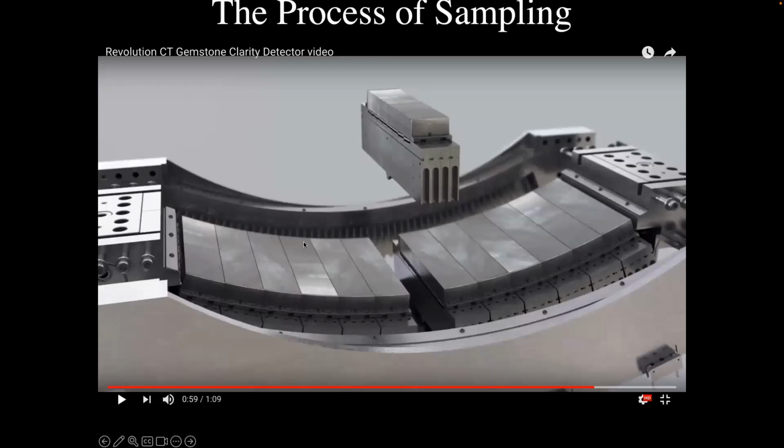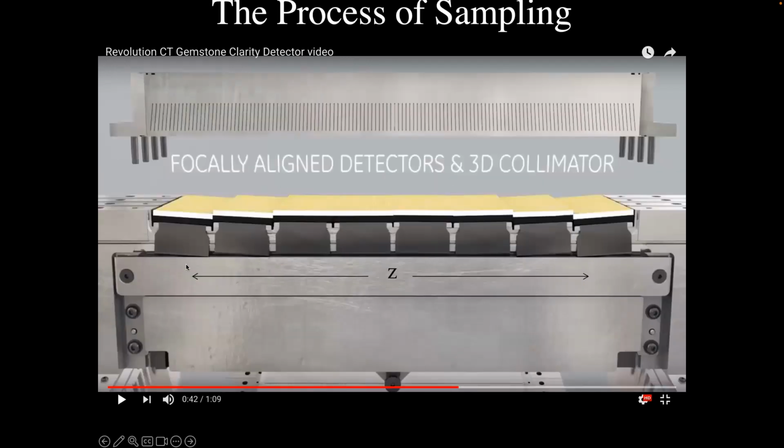If you look at what the detector array looks like hardware-wise, this is Z in this direction, and we'll call this direction theta. So I have about 892 detectors in this direction, 256 in this direction. And the way we make so many detectors is you break it up into little chips or chiclets. They're not silicon chips, they're like little chiclets. And they're inside here. I think I have a picture of it. Yeah, here they are. So this is Z now.